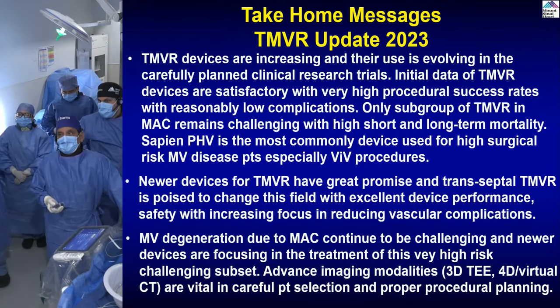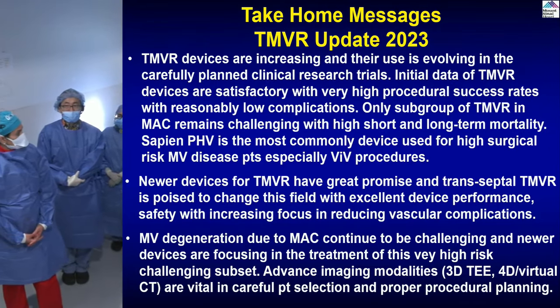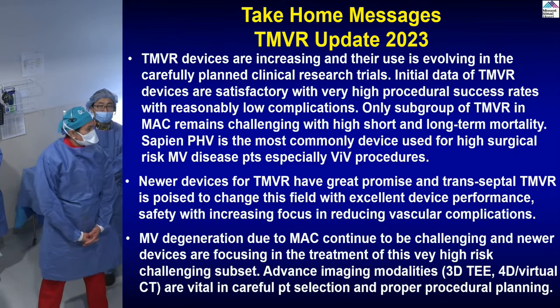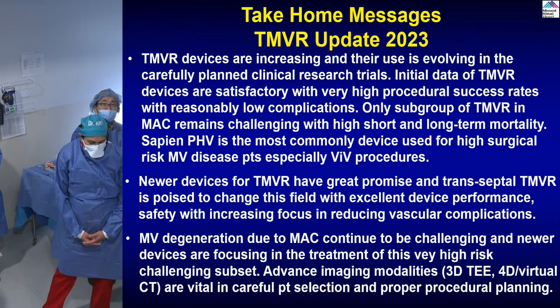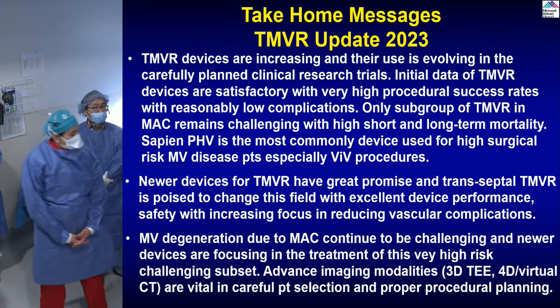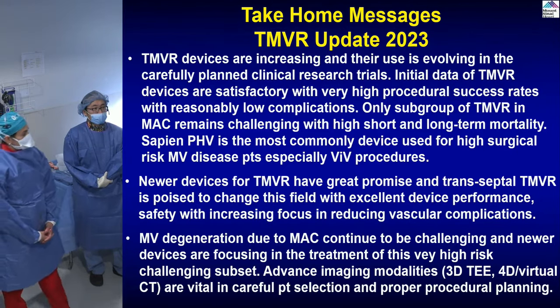I think even the valve, once the learning curve is done, like we showed, we could be as fast as we just showed today. I know from cut down, we have to move to percutaneous. Though the current device has multiple knobs, once we learn, we should be able to get it. But the question is, since anatomy is so complex, would we get one or two valves that will come to the finish line?